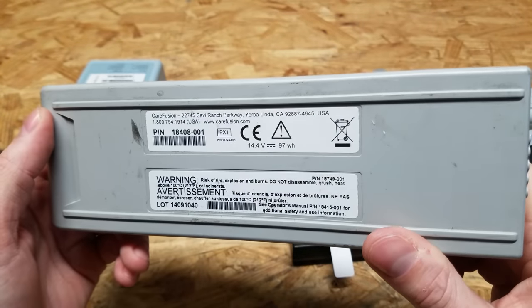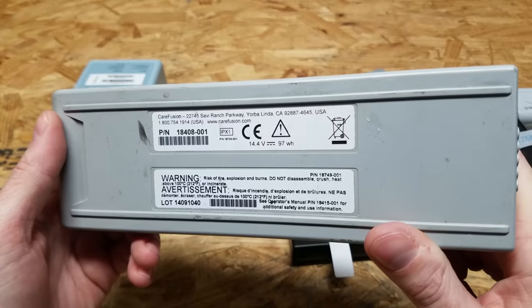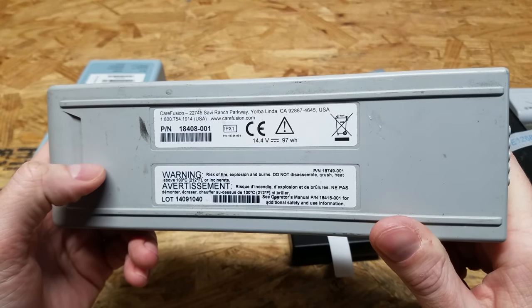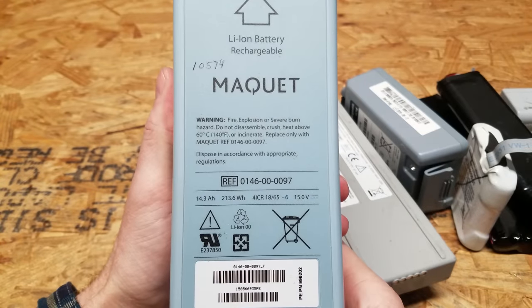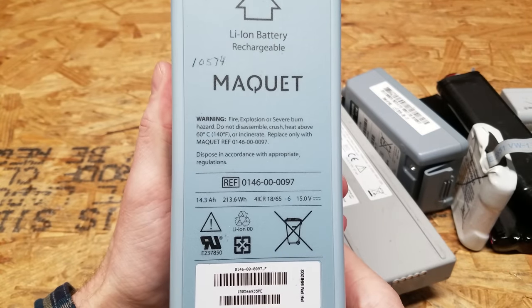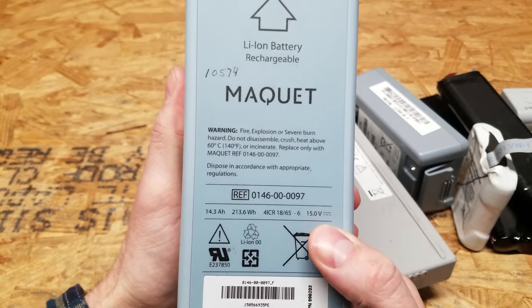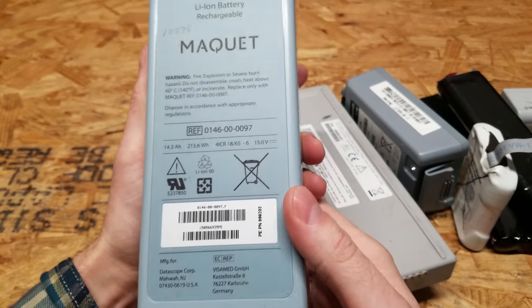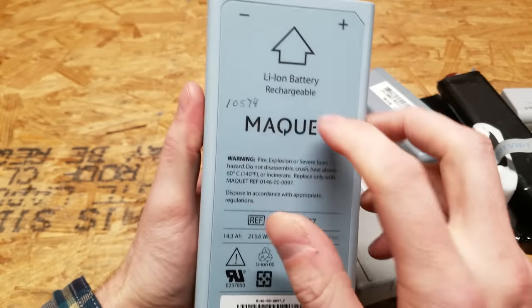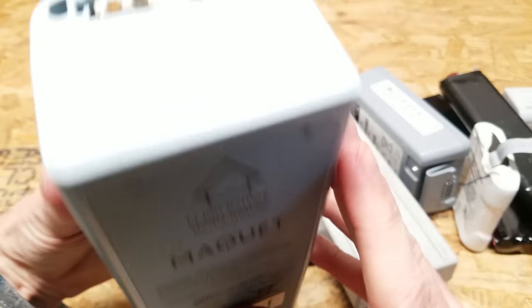As we go up the scale in size, this one is 14.4 volts, and that's going to be 4S, most likely 3P if I had to guess. The largest battery pack comes in at 14.3 amp hours and 15.0 volts. That is an interesting voltage for a lithium battery — is this even lithium? It does say lithium ion up there, so we'll see what's up with this one.